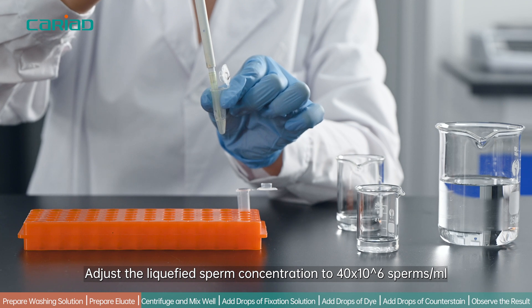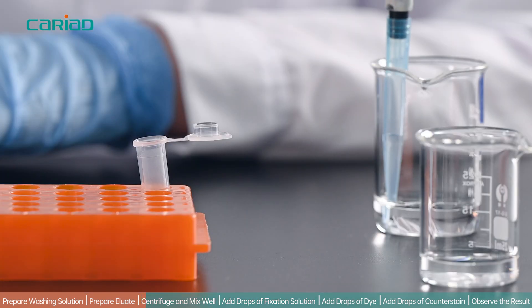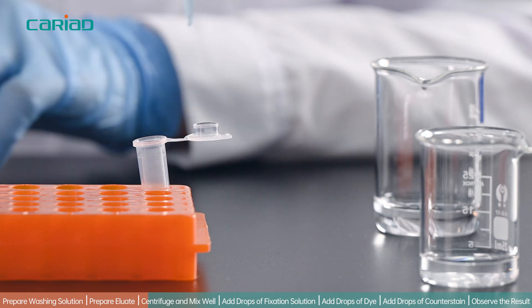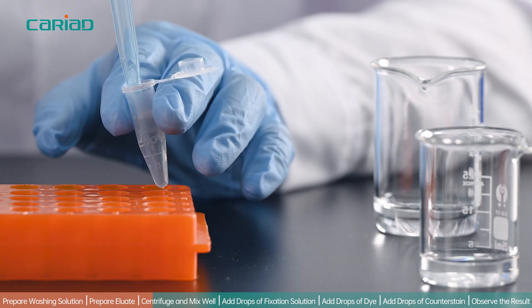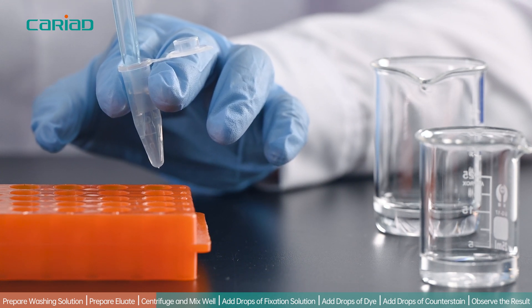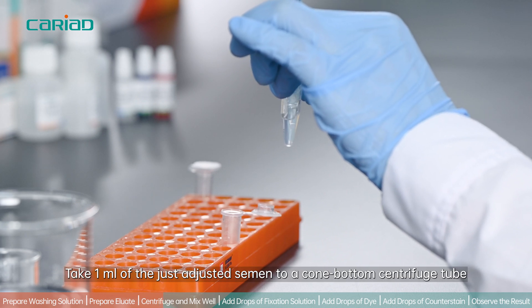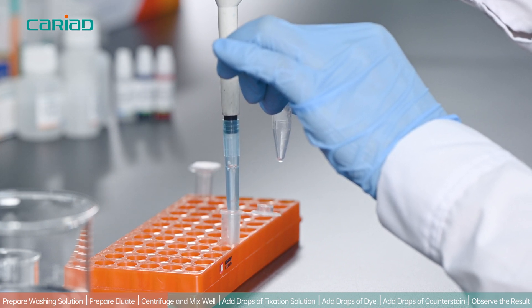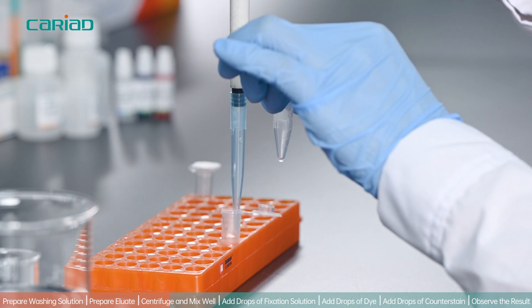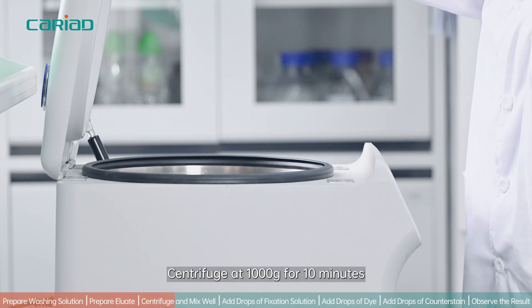Adjust the liquefied sperm concentration to 40 × 10⁶ sperm per ml. Take 1 ml of the just-adjusted semen into a cone-bottom centrifuge tube. Centrifuge at 1000g for 10 minutes.